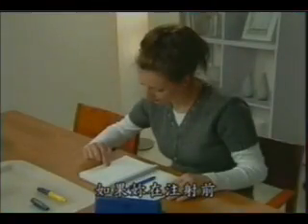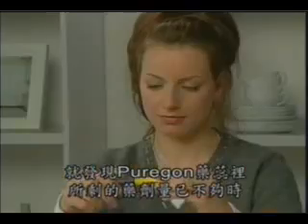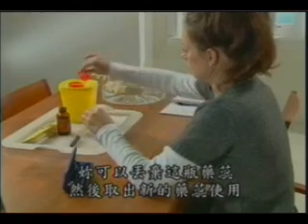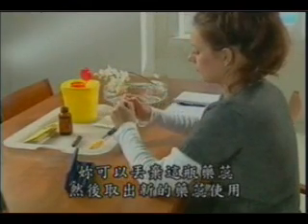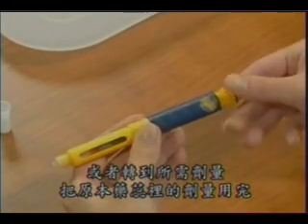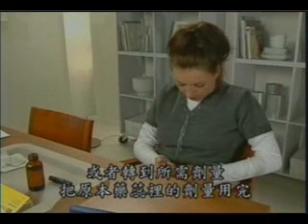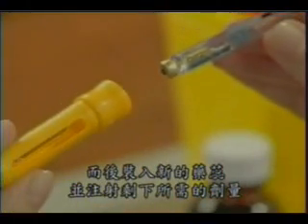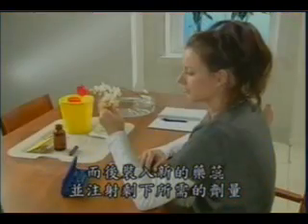If you realize before starting the injection that you do not have enough drug in your Puregon cartridge for your dose, you have two options. You can either dispose of that cartridge and change to a new Puregon cartridge and take your dose, or dial the prescribed dose. You can finish the Puregon cartridge which is in the pen, followed by reloading the pen with a new cartridge and taking the remainder of your dose from that new Puregon cartridge.